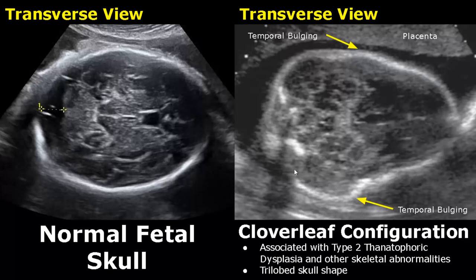The shape of the skull is trilobed. These bulging areas on either side are bulging of the temporal bones. The clover leaf configuration is caused by craniosynostosis of all the sutures — these bones join together too early and the skull shape is deformed.